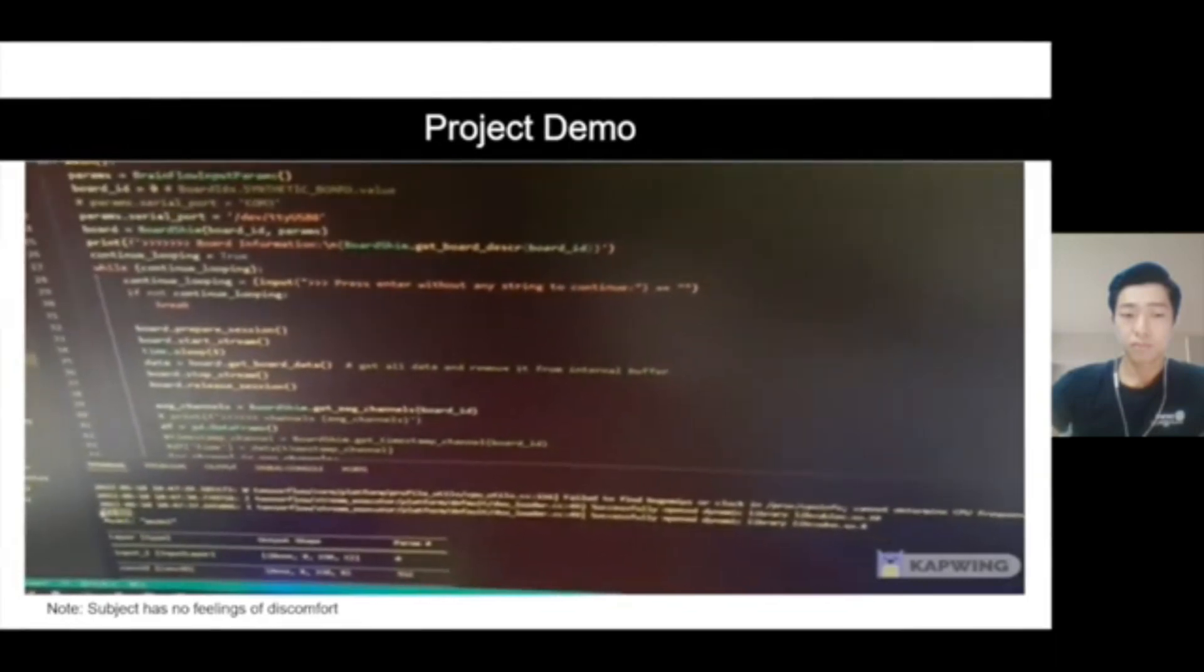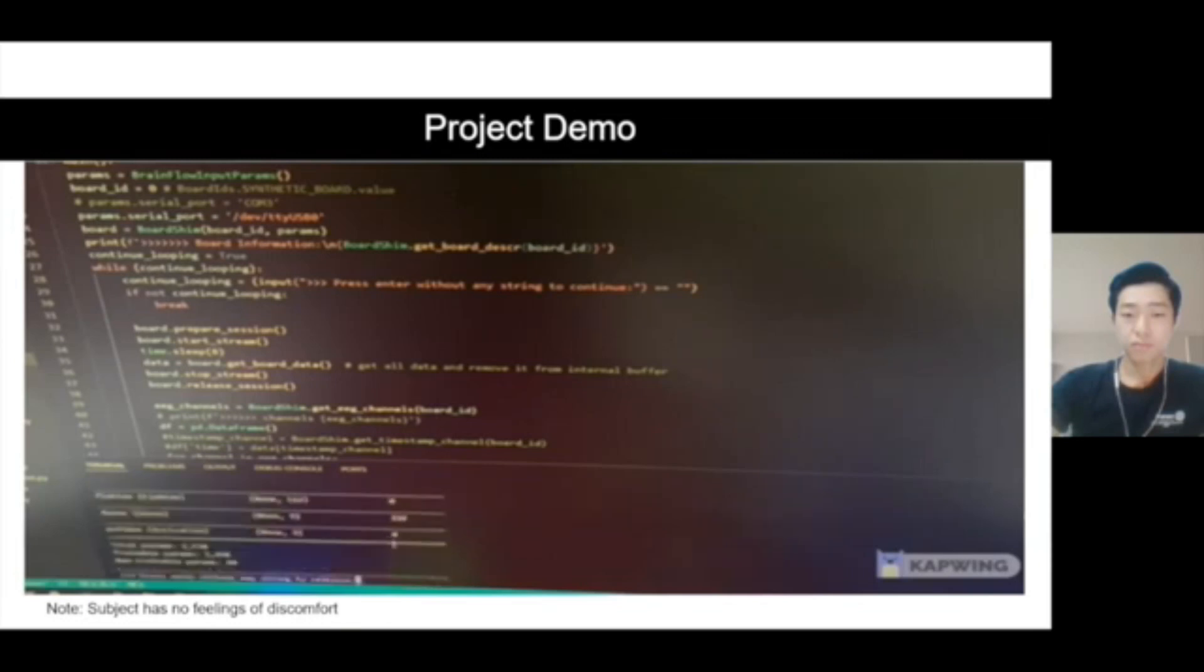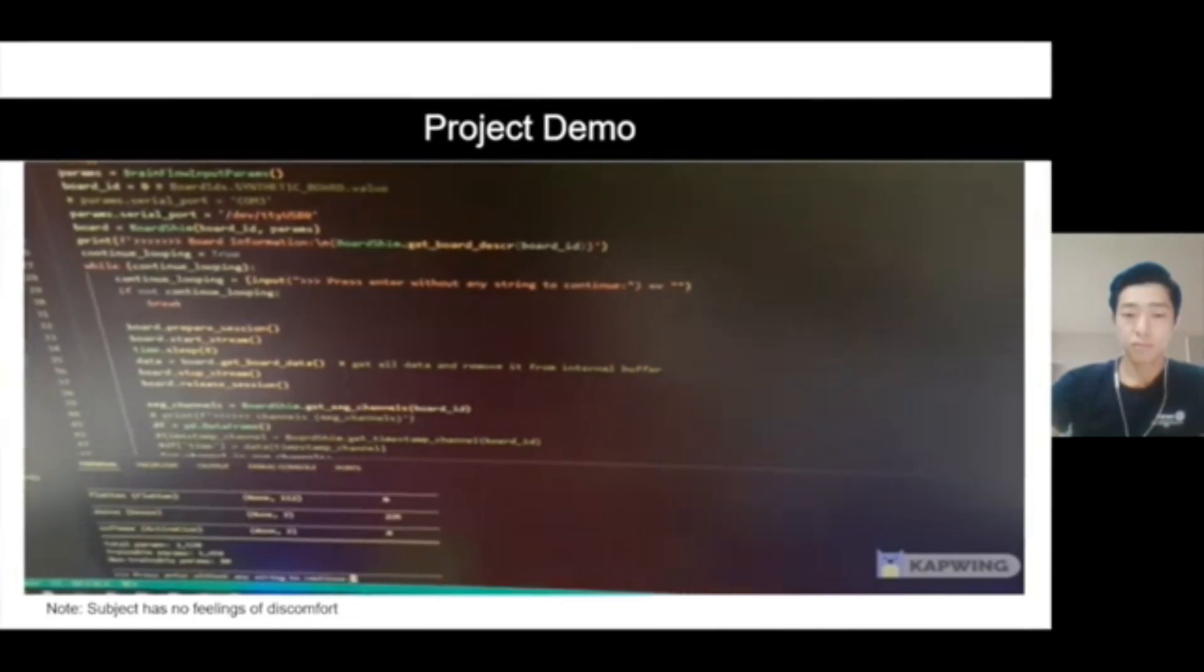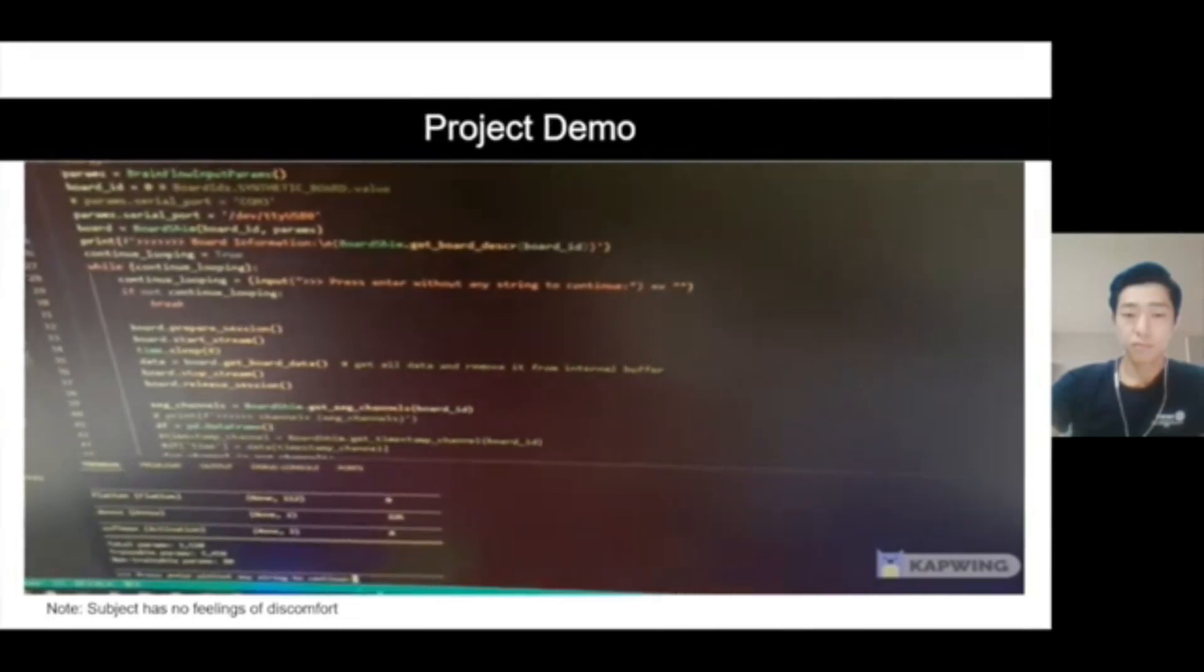As you can see here from the terminal, a 1 is indicated at the bottom of the terminal. That means the directional control of the live EEG signal is pointing to the right. And at the bottom here, you can see press enter without any string to continue. So when I press enter, the loop will initialize again.